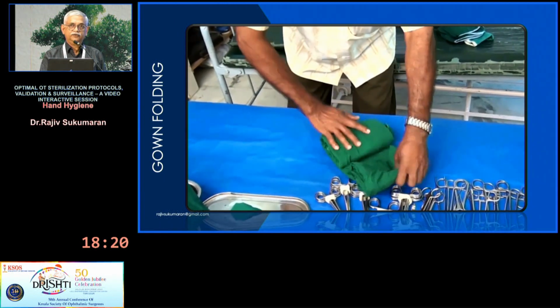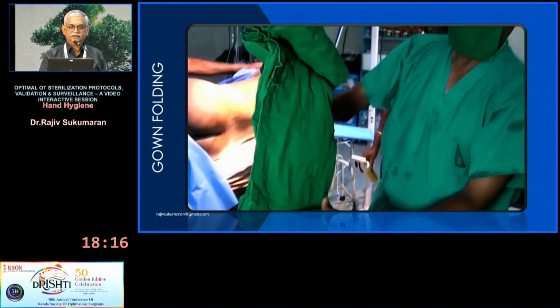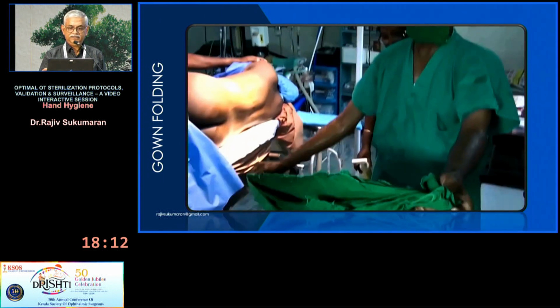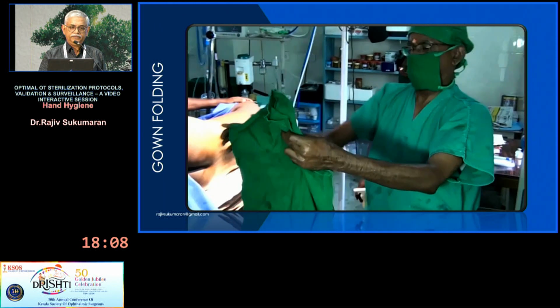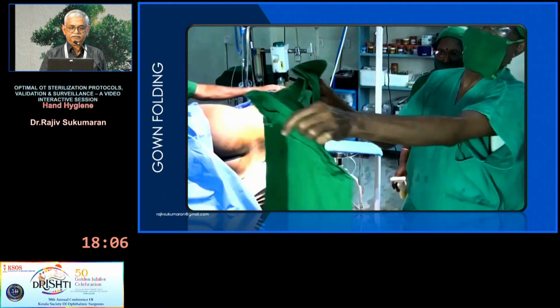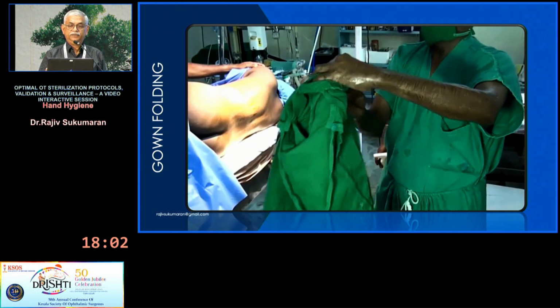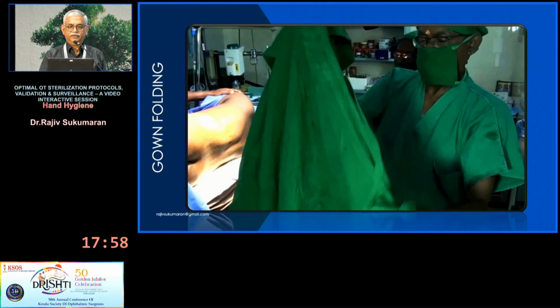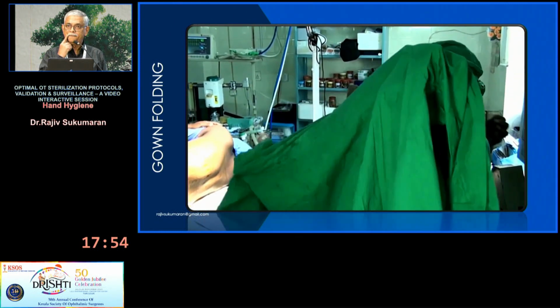This is in a gynec hospital which I recorded, and the anesthetist has come. He is opening up and seeing, he doesn't know which is the head or the tail of the gown, and trying to open it, the front, back, everything is confusing. Ultimately, he has contaminated the entire thing with his wet hand. So, he is wearing. There is a proper way of folding the surgical gown.